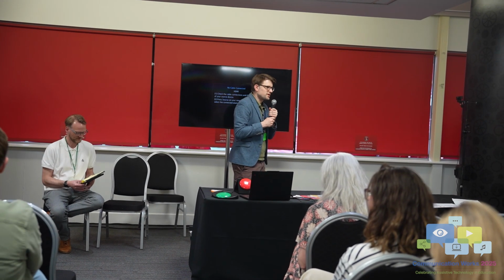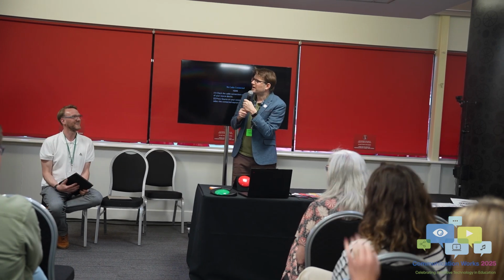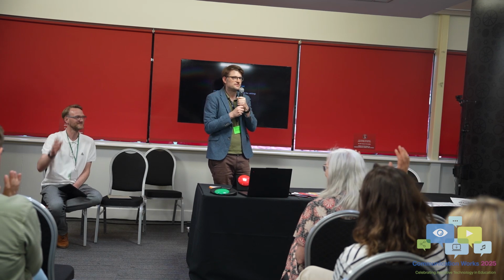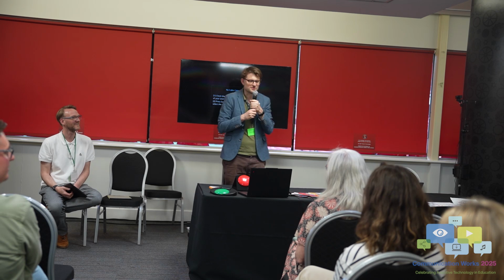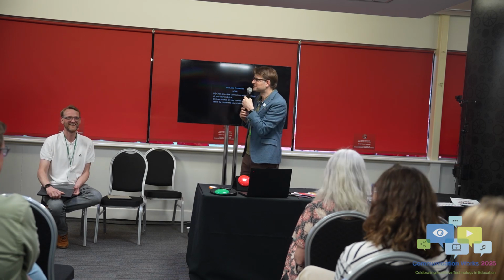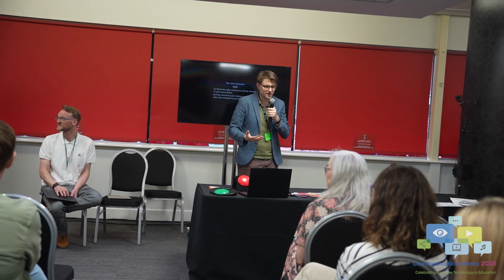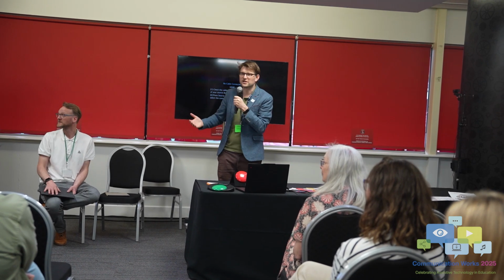So the first quick question is why do we use switches? Just put your hands up if you know about switches. Yeah. A few. Put your hands up if you know about scanning. Yeah. That's quite a lot of people. I think that's pretty much everyone. If you don't know about scanning, ask the person next to you. Save me 30 seconds. So basically, you use switches for playing, for controlling the environment, for mobility, communication, learning and education.